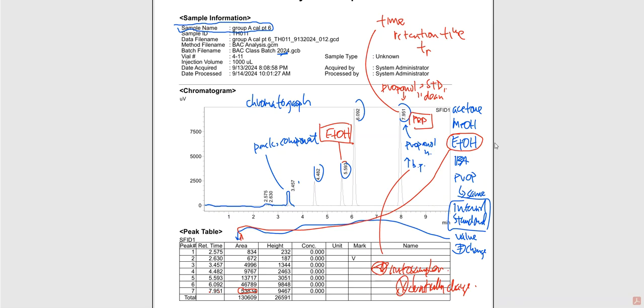And by the time that we do the math, it's going to correct. Because if I get more internal standard, it's probably more sample that was injected. If I get less internal standard, that's probably less sample that was injected. My internal standard was in my samples as I injected them, so they should go hand in hand. That way I can correct for these slight differences that begin to happen in the auto sampler.